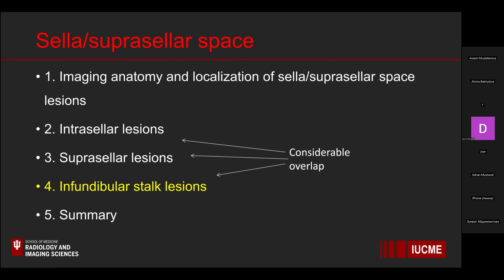Not very much in my experience, because both can be hypercellular and give you some degree of diffusion restriction. That is why we rely on the other clues that we talked about, just because diffusion can be similar in both of those lesions because they both happen to be hypercellular. And one may be more heterogeneous than the other, giving you more diffusion restriction. So that is unfortunately not something that helps us differentiate in the clinical setting.